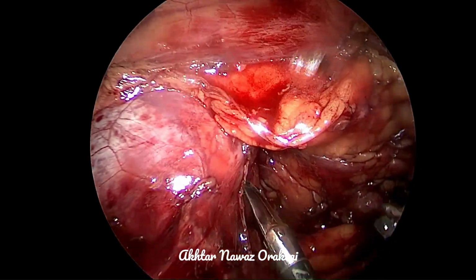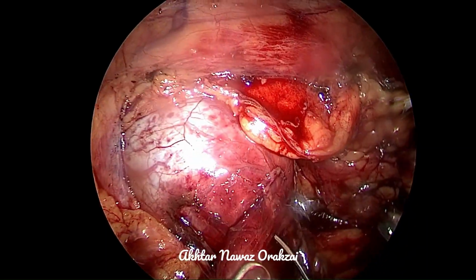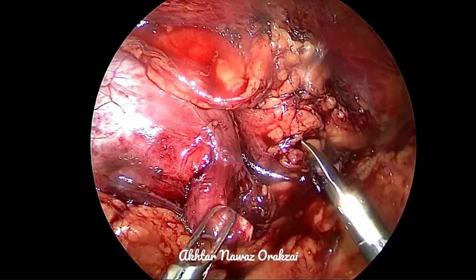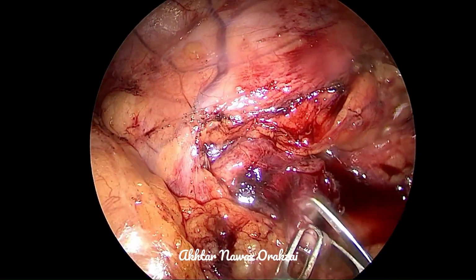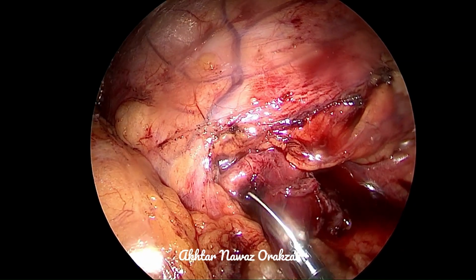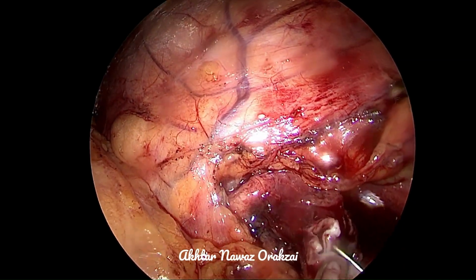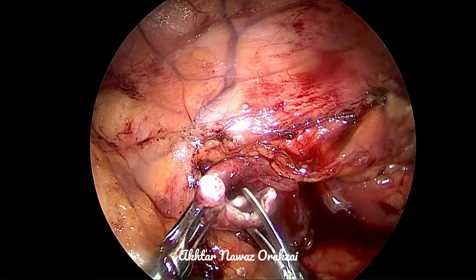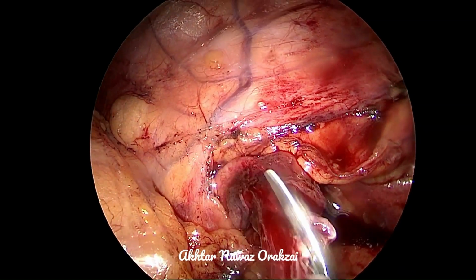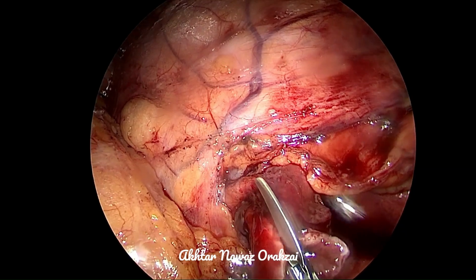We clean this portion. This portion, as you can see, is going to come down, so this portion should not be excised. However, we can see that the segment is lower down, so we can very easily excise the pelvic portion above that segment. In this case, it is quite easy because the pelvis was coming down in a funnel shape.